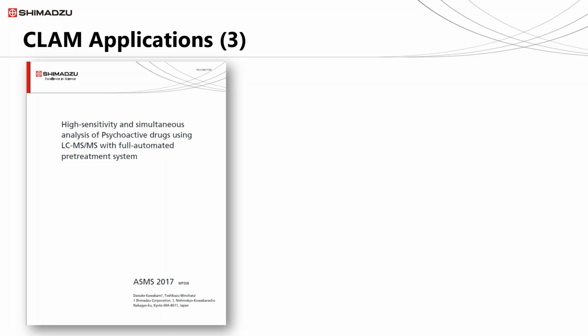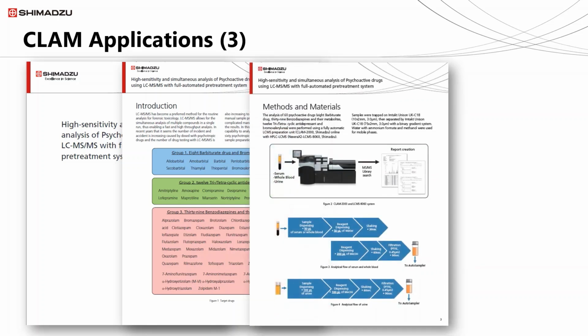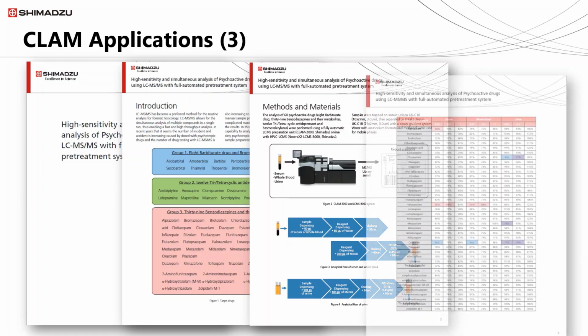Let's see one more application on CLAM 2030. By now you must have noticed that many routine LCMS applications, especially samples with biological fluid matrix, have been converted with this automated system of CLAM 2030.